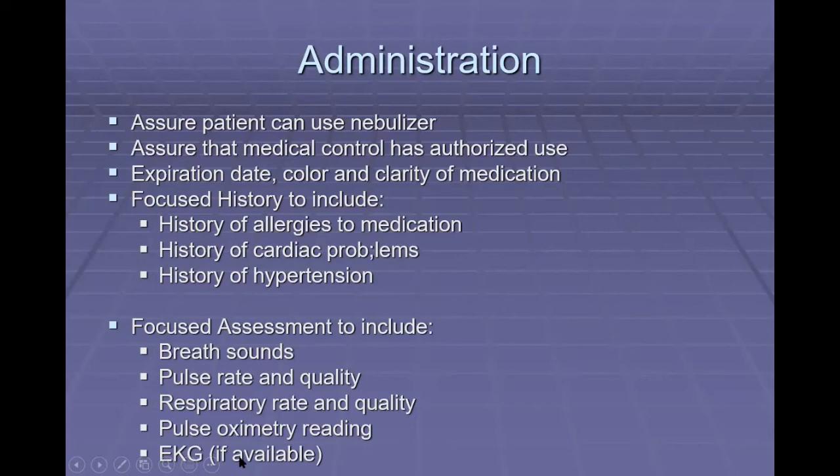So our focused assessment should include breath sounds. The reason we want to check breath sounds is that we don't just give anybody and everybody a nebulizer. We want to see that there is an indication for the need for this medication. If the patient's having trouble breathing, and we're listening and hearing breath sounds that don't sound normal, we want to make sure that we document that, because this is an indication for the use of this medication.